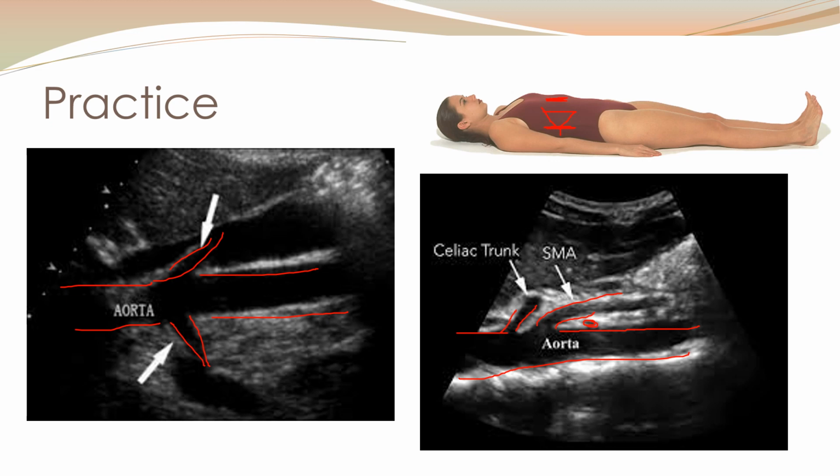the renal arteries. Now, if I were to move back to the mid-sagittal plane longitudinal view, I would never see a renal artery in this image because I'm at midline to the aorta and the renal arteries are coming off the lateral aspects of the aorta. So that wouldn't be something I could pick up there. So this coronal view can be very, very useful in certain applications.